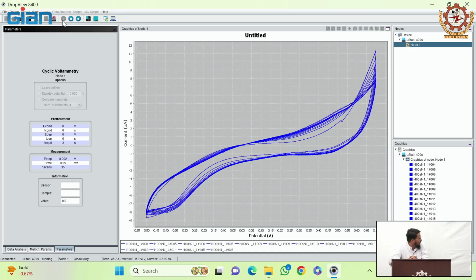So, one more thing to note here as well is, the CV curves are more or less overlapping, but they will overlap in such a way that the area under the curve will reduce gradually. So, as electropolymerization is taking place, as the surface is being coated, the area under the curve will get less.